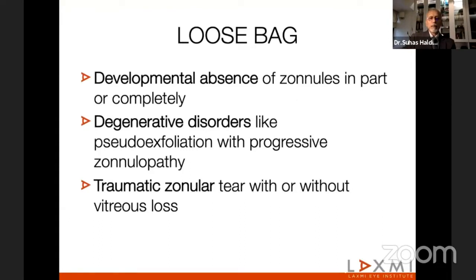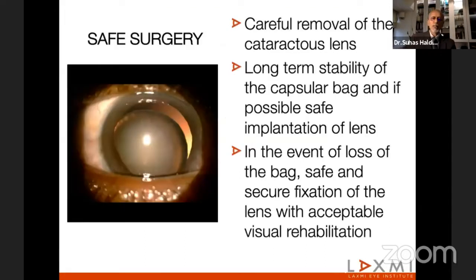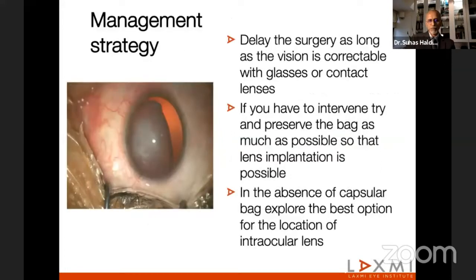A developmental absence of zonules, or degenerative disorders giving you cases like pseudo-exfoliation, or traumatic zonular tears. And when it comes to safe surgery, it simply is careful removal of the cataractous lens, long-term stability of the capsular bag, and in the event of loss of bag, safe and secure fixation of the lens with acceptable visual rehab.